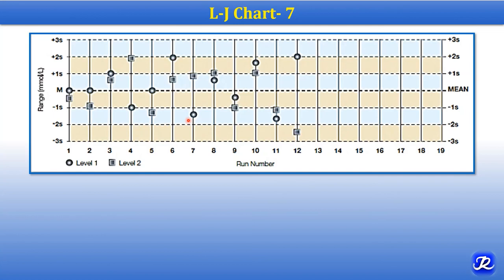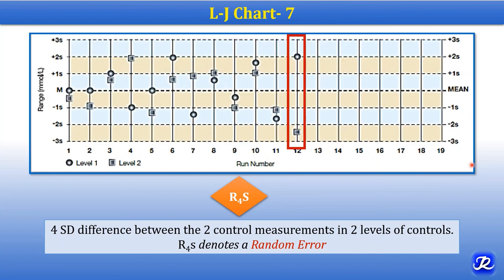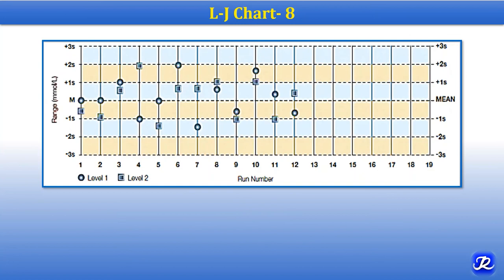This chart is also for two levels of control. Observe all the control values. At the 12th run, there is a four standard deviation difference — 1, 2, 3, 4 — four SD difference between the values of the two levels of control. Level 1 is here and level 2 is here. When there is a four standard deviation difference between control measurements of two levels, it is the R4S rule. There is a 4 SD difference between two control measurements in two levels of control, and it denotes random error.